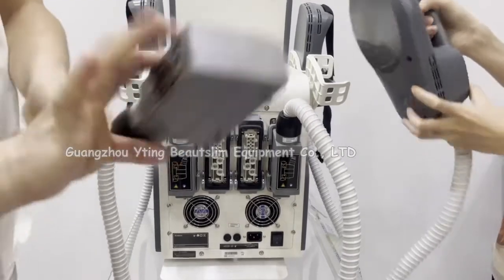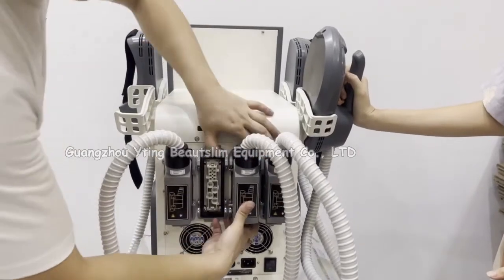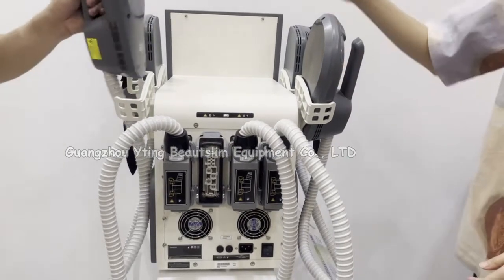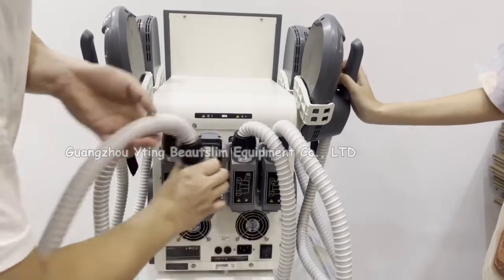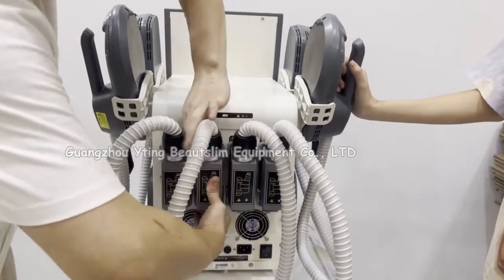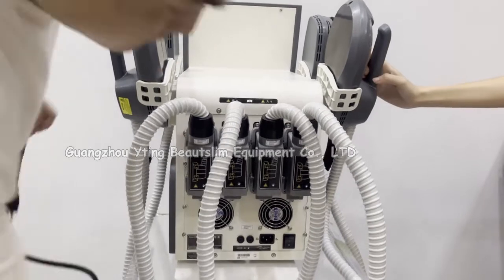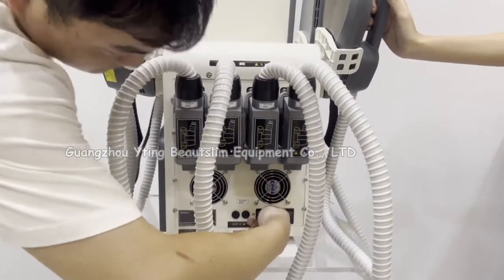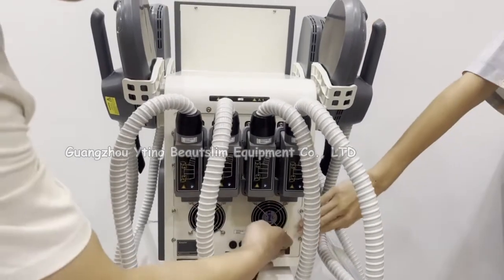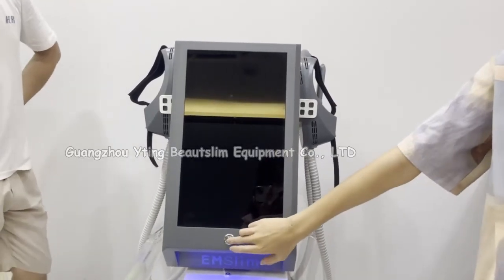And then connect the big handles. Connect the power cord. Press this button to turn on the machine.